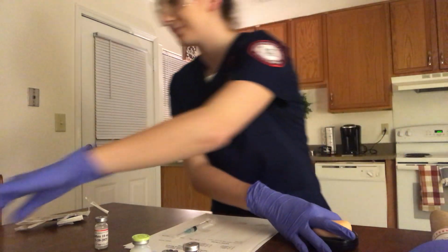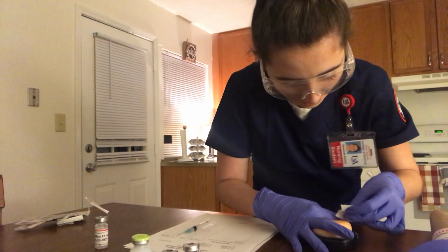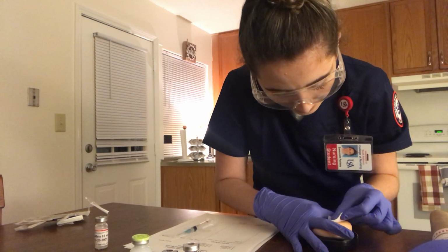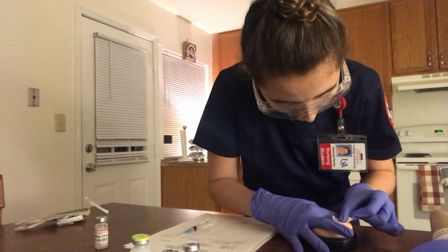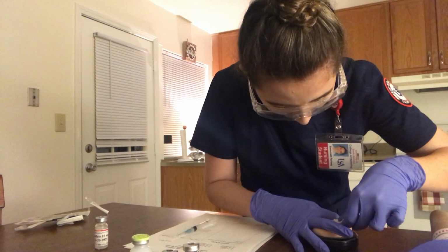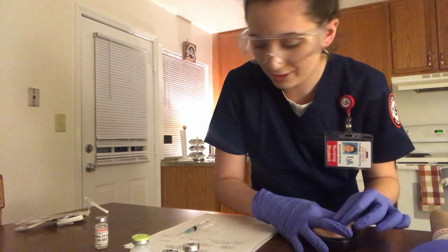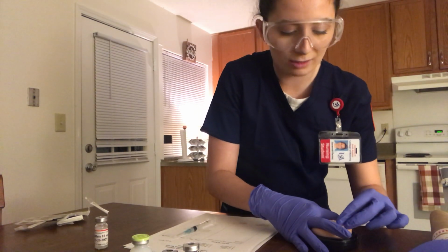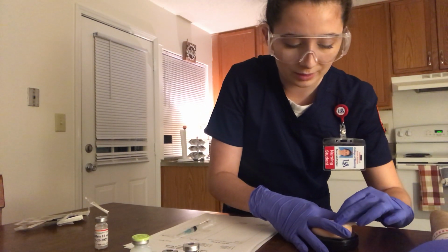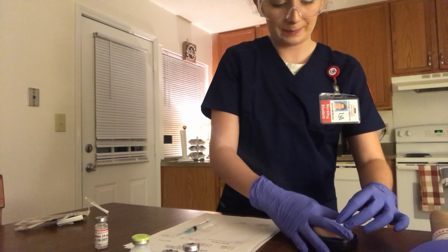I will then take an alcohol swab and clean the injection site. I'm not going to give the patient the medication in this hand formation. So I'm going to point my alcohol swab towards where I want to put the needle in.